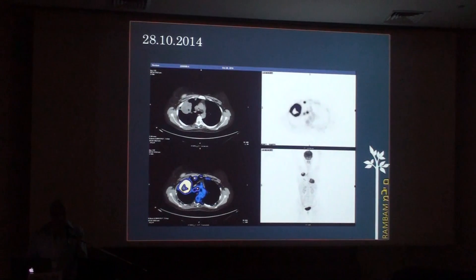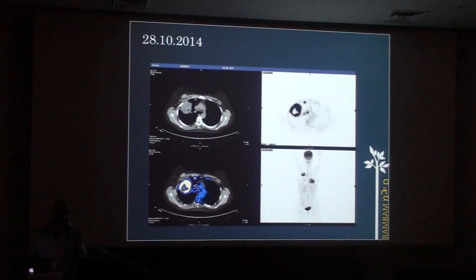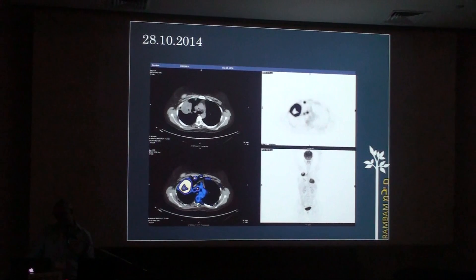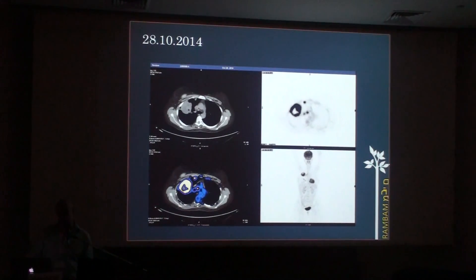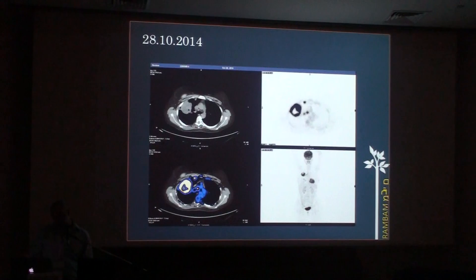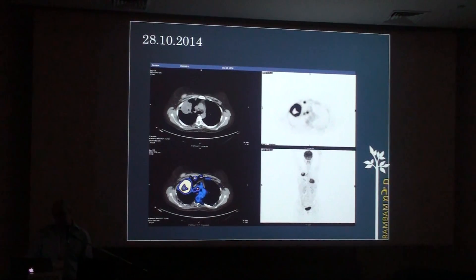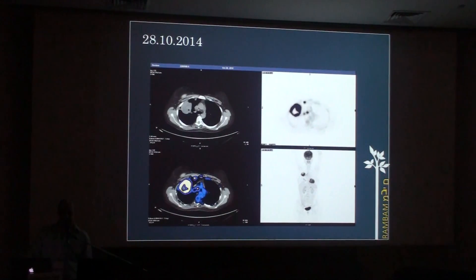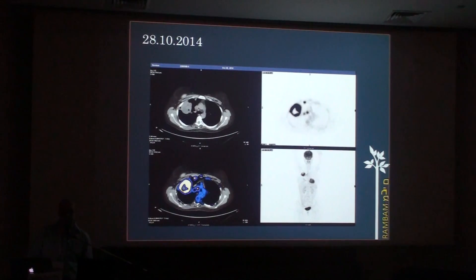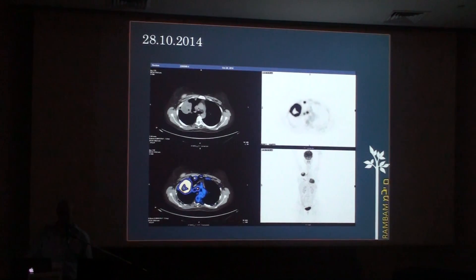A few days later she had a PET CT. On the PET CT we can see uptake in that lesion, uptake in the subpleural nodule, and uptake in the mediastinal lymph nodes. We can also see an area without uptake in the middle of the lesion which is again hypodense, again suggesting a probably necrotic area.